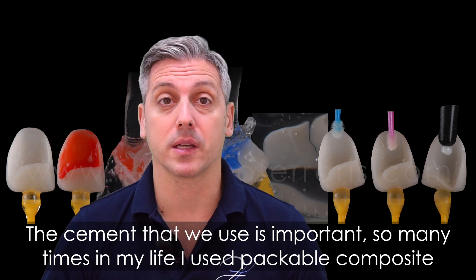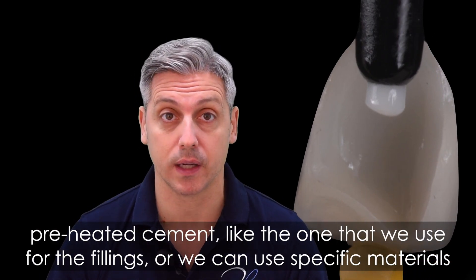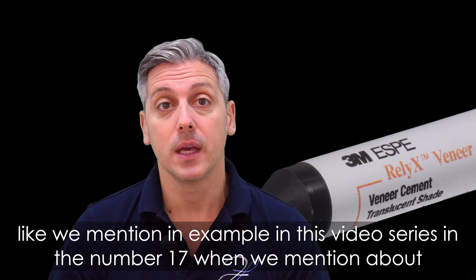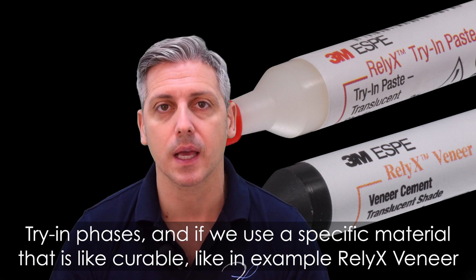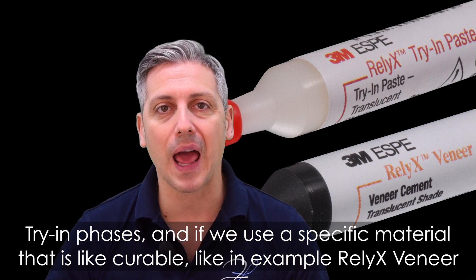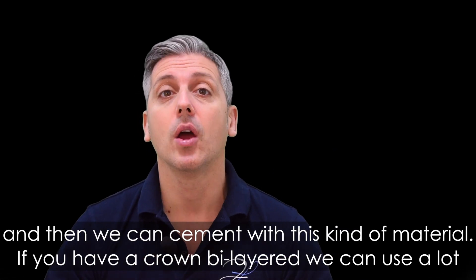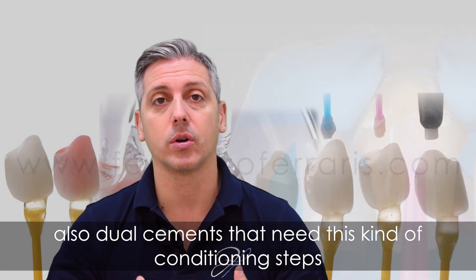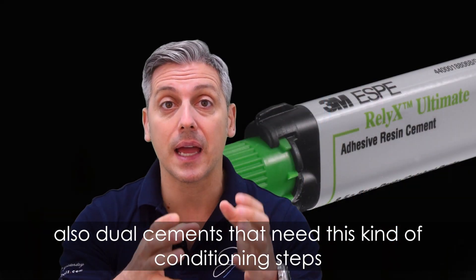The cement we use is important. Many times I use a packable composite preheated cement, like the ones used for fillings. Or we can use specific materials — for example, as mentioned in video number 17 in this series — where we discussed trying pastes. If we use a specific light-curable material, like Variolink Esthetic, the try-in paste lets us assess the esthetic outcome, and then we can cement with that material. For a bilayered crown, we can also use a dual-cure cement, which requires these same conditioning steps.